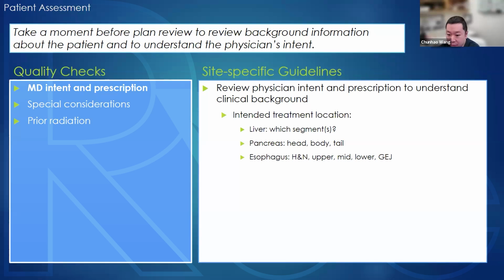pelvis cases as well. All right, so it's important to understand the treatment location for GI because there could be so many variations about the location of the treatment. That matters to us about how to do the best simulation and how to develop the best treatment strategy.